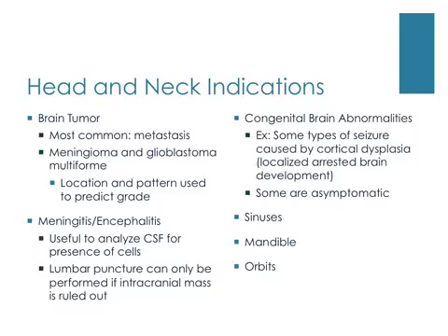The orbits are important to image under CT imaging for similar reasons that the sinuses are. The CT images actually help the surgeon locate foreign bodies when they are doing a surgery inside the orbits.